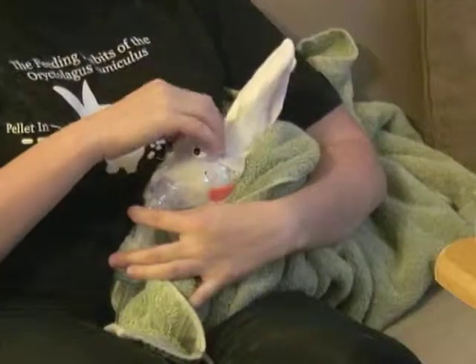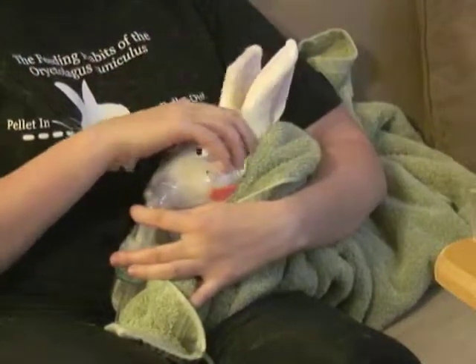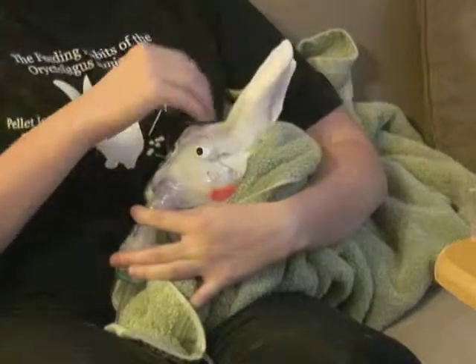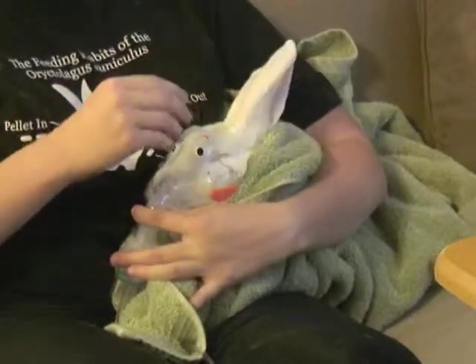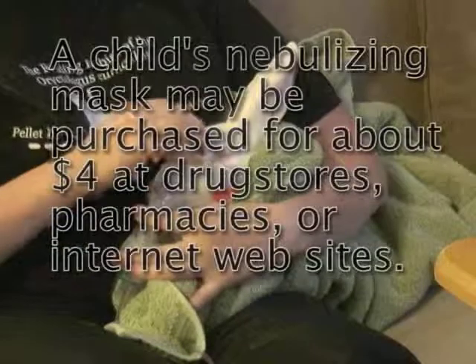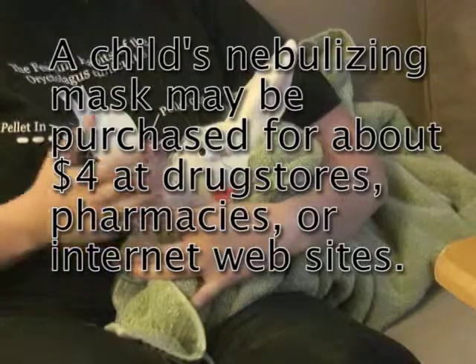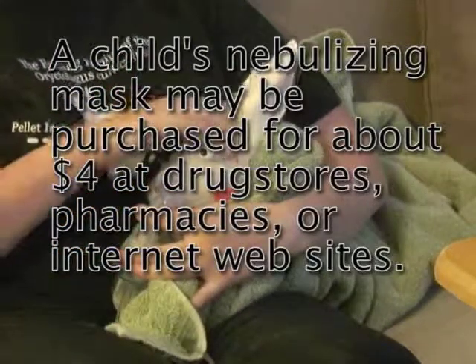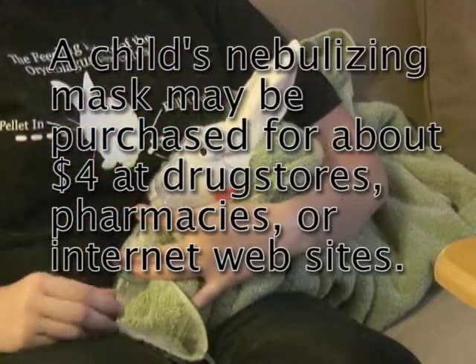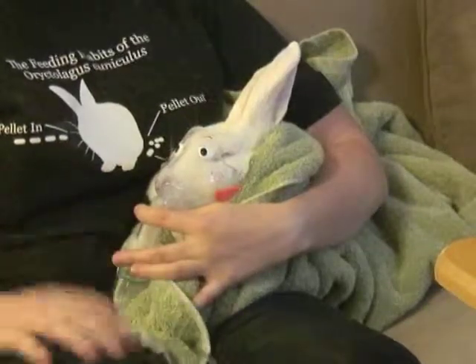The first day after I brought the nebulizer home, I tried to make the nebulization chamber. I just kind of thought surely we must be able to get a mask and give it a try. For $4 it's worth seeing if she tolerates the mask. It's probably been 48 hours of this method of nebulizing saline.